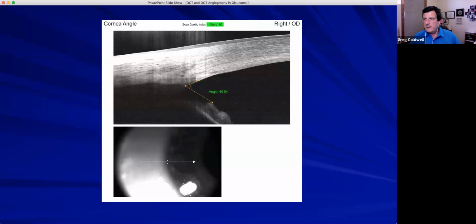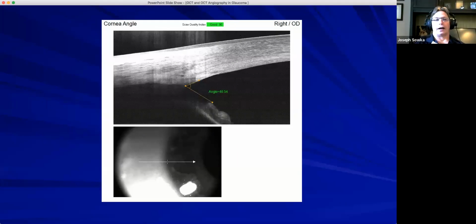Joe, any comments on that? That's one of my soapboxes, but do you have any comments that you want to throw in there? I know you're a big glaucoma guy. I agree entirely. The only thing I want to throw in, in terms of risk, is what about the stratified risk in the person who's had LASIK and has been iatrogenically thinned? I think we just don't know about that, other than that we may not be measuring the pressure correctly.